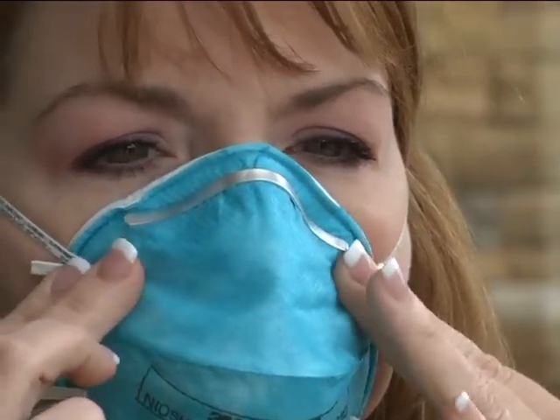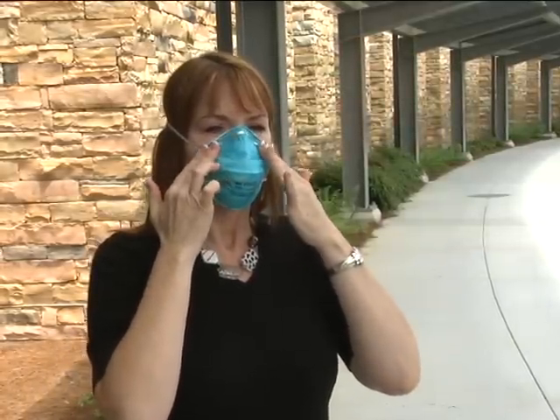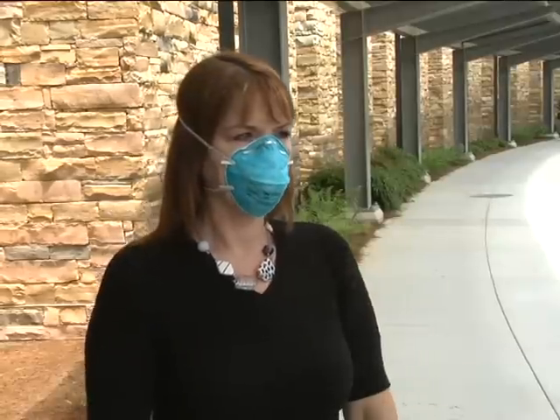Place your hands on the surface of the respirator and take a quick, deep breath. If you feel air blowing around your face or eyes, the respirator may not fit your face properly. Readjust the fit of your respirator and check the seal again.